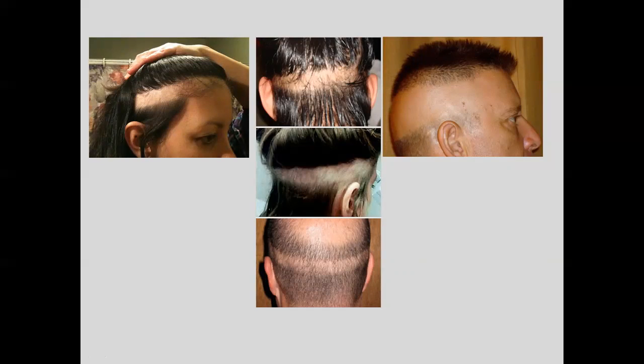They had their scanner set in a demo mode, and when they first got it, the technician who set it up didn't take it out of that. They were scanning patients in demo mode, which is a super large amount of radiation, and they didn't know about it because they weren't tracking or looking at their doses. Then patients started showing up a few months later with hair loss, and that's how they found out about it.